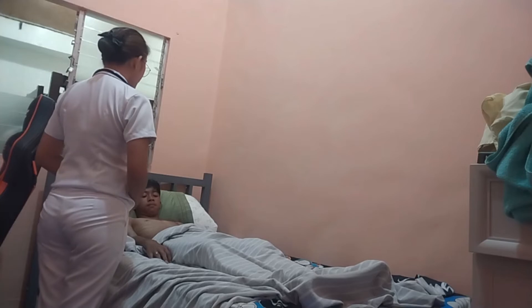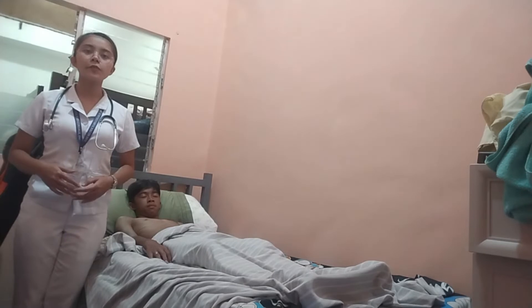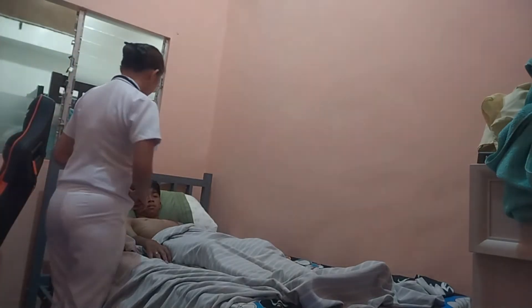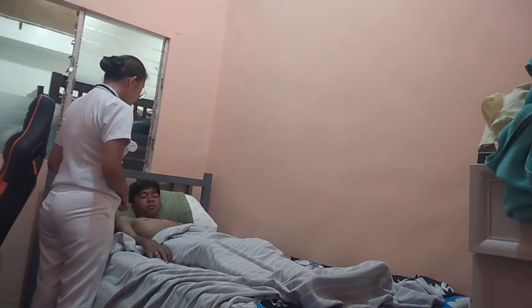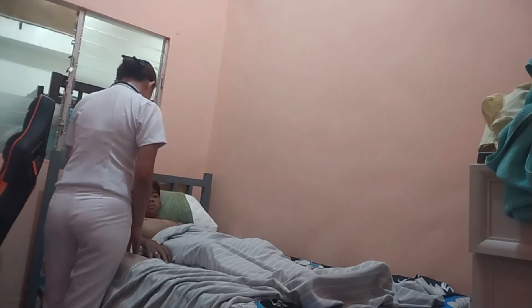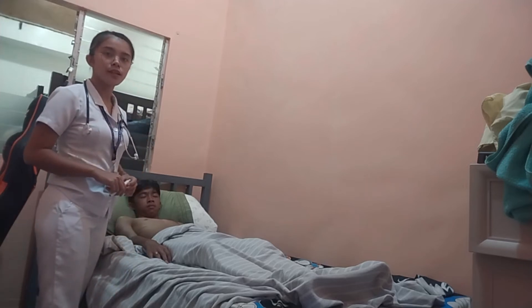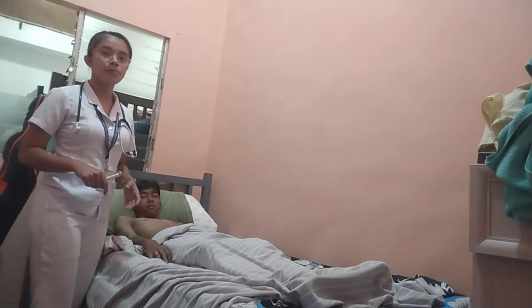Sir, I will now inspect your chest area. I will proceed to the assessment of the heart, beginning with the general inspection of the chest wall. I am looking for any abnormal pulsations, symmetry of movements, scars, or lesions, which I don't see. I will use my pen light to shine a tangential light across the chest wall over the cardiac apex to make any movement more visible.